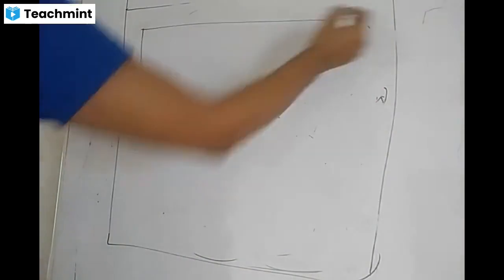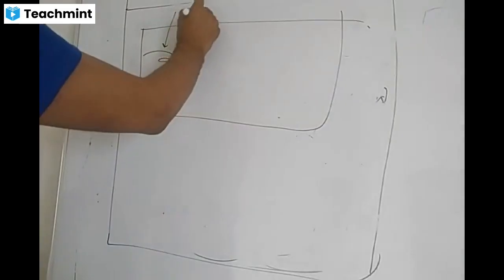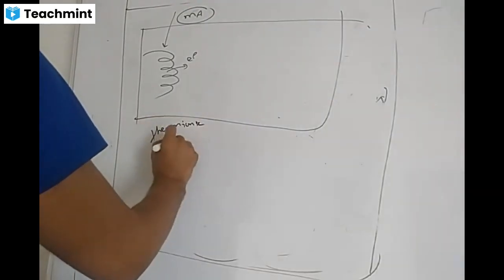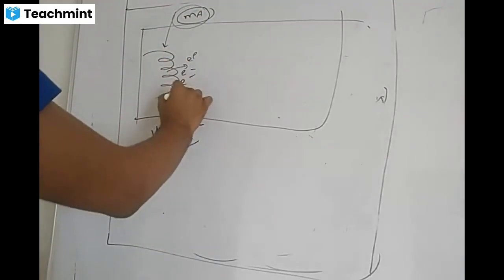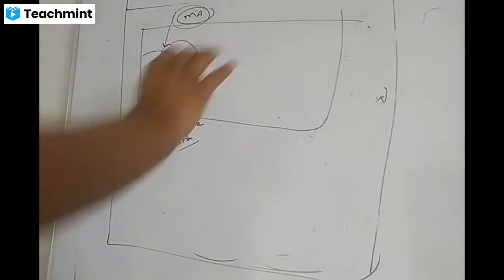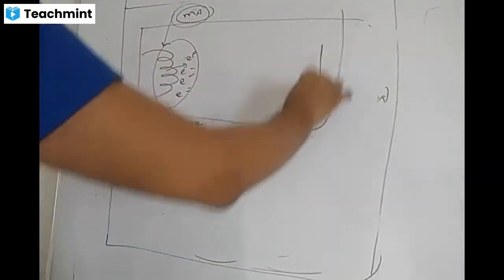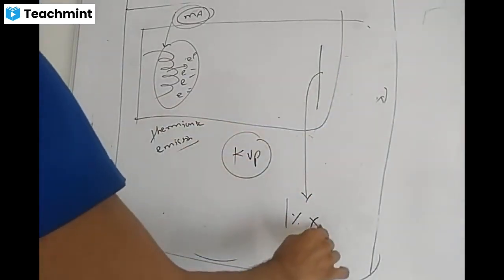So in this X-ray tube, we are done with two concepts. One is your mA, which is related to the concept of thermionic emission. You give the current, it will hit the filament, and what comes out? Electron cloud. Then the first duty is over. The X-ray tube says that if you give something called kVp, these electrons will move to the anode and lead to production of your 1% X-ray.